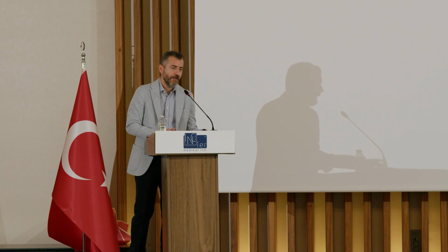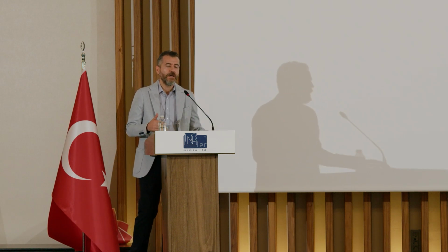Okay, so do you operate in what position? Supine. Supine. Yeah, actually, I'm doing supine PCNL, only supine PCNL for more than 10 years now. And almost all of my surgeries are combined surgery with retrograde access as well, unless the ureter is not wide enough.